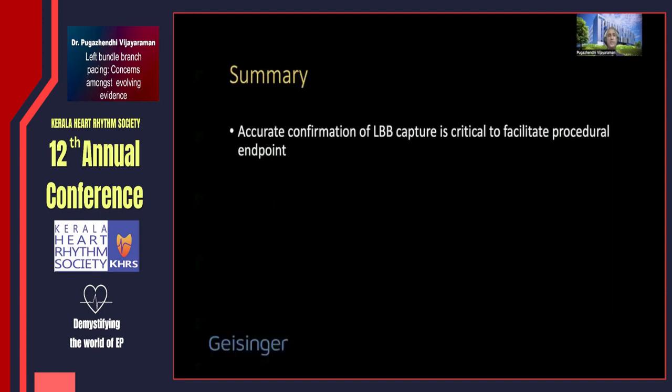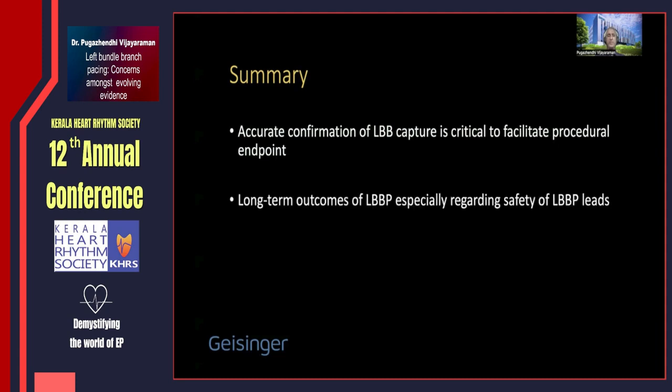So in summary, accurate confirmation of left bundle branch capture is critical to facilitate an acceptable procedural endpoint. Long-term outcomes of left bundle branch pacing, both clinical and safety outcomes, need to be studied carefully so that we don't get too deep into this before realizing the negative effects of left bundle branch pacing.